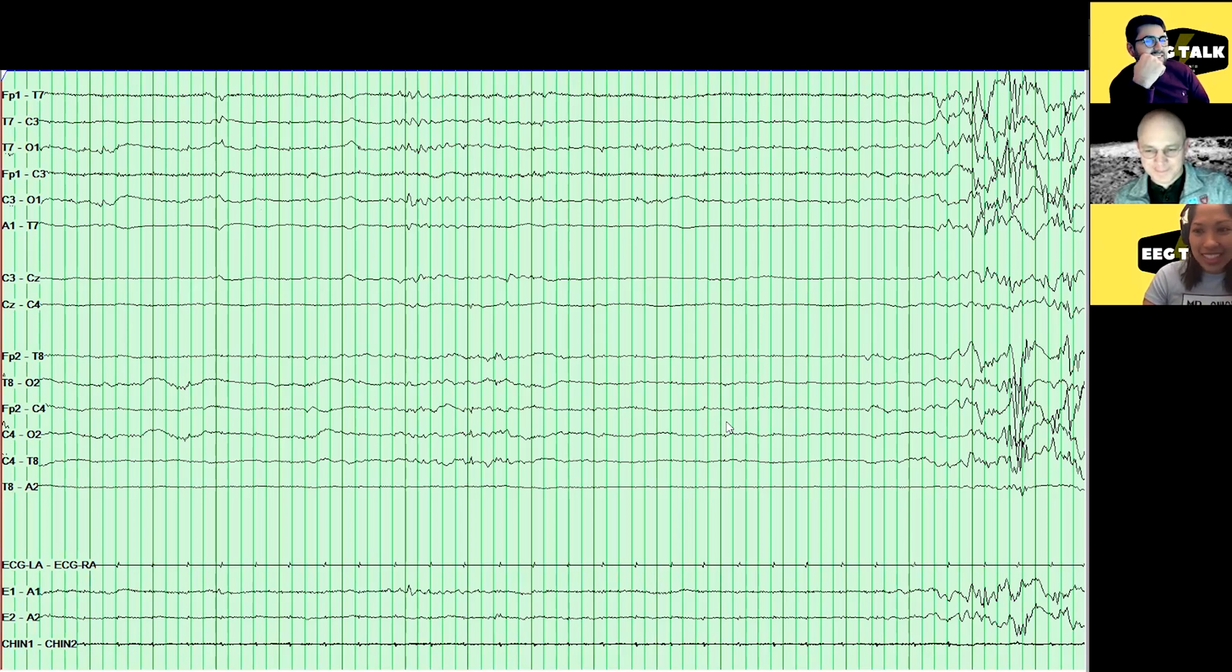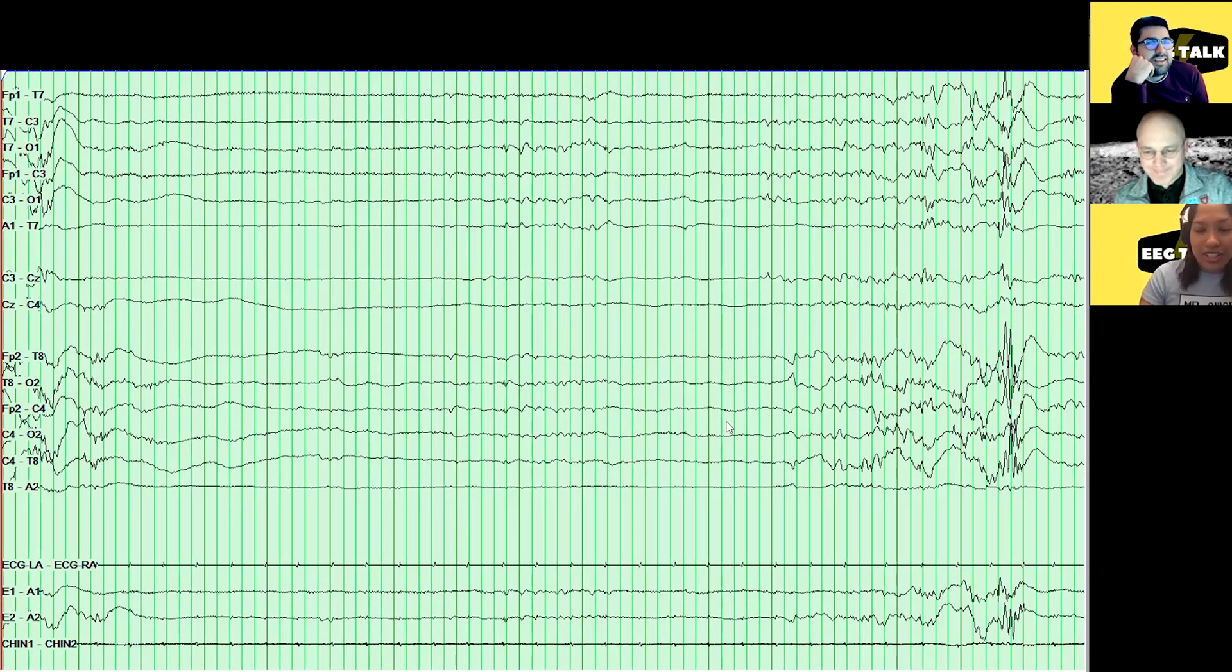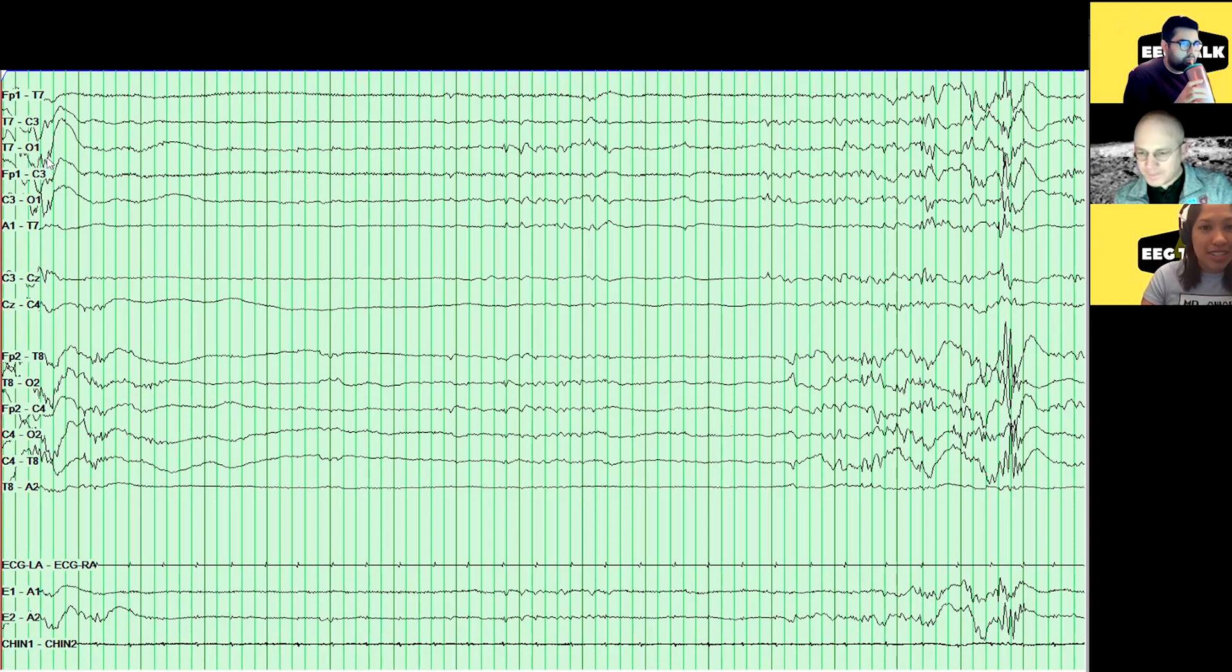Nice. Are those delta brushes, Audrey? Yeah, there are some delta brushes kind of thrown in here. Some are better examples than others, but yeah, here's a delta wave with some superimposed beta. So that's an example of a delta brush. And for this baby's age, that's normal.